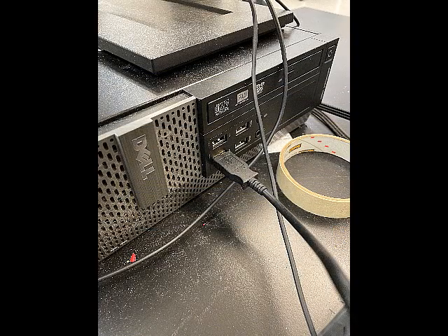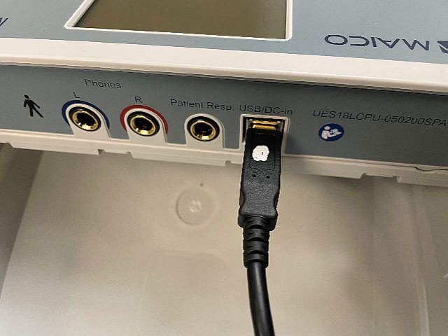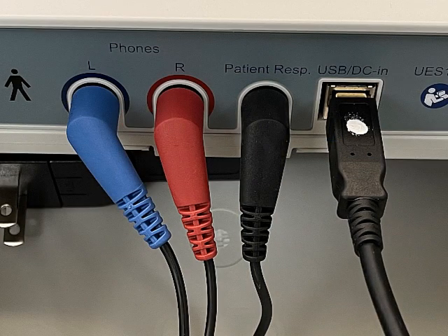Plug one end of the USB cable into the lab PC. Plug the other end of the USB cable into the audiometer — the white dot will face up. Plug the headphones and the patient response switch into the proper jacks. Info is on the lid of the audiometer.